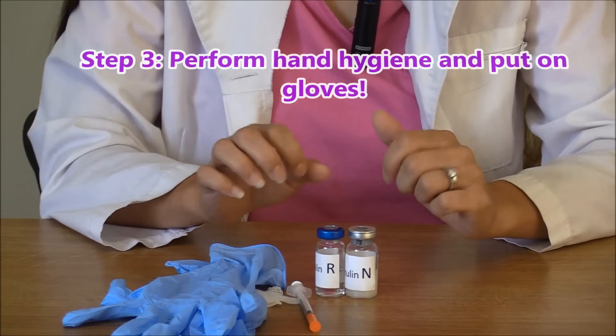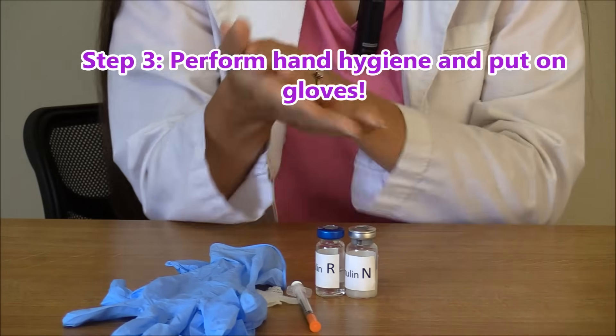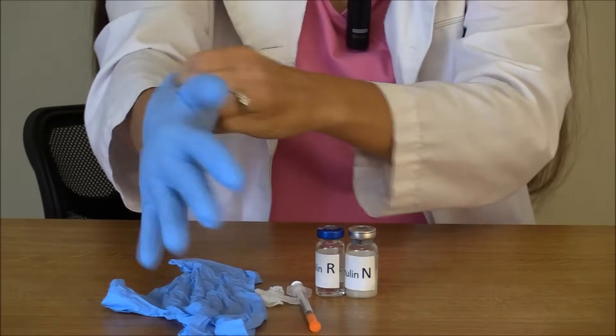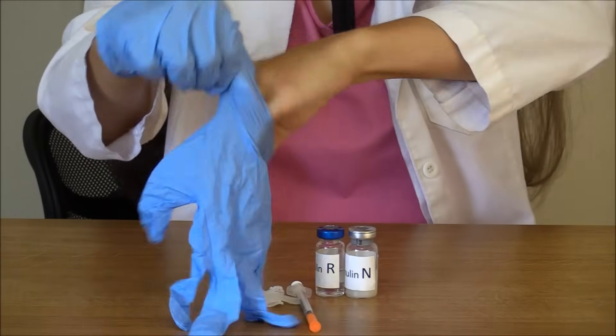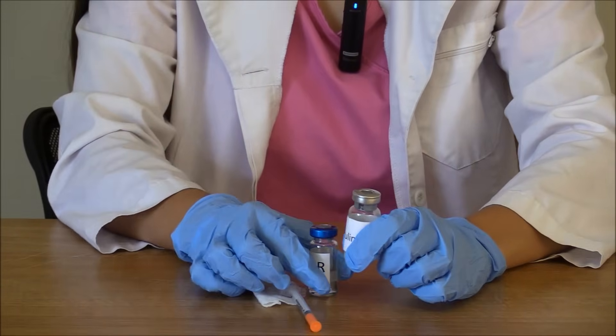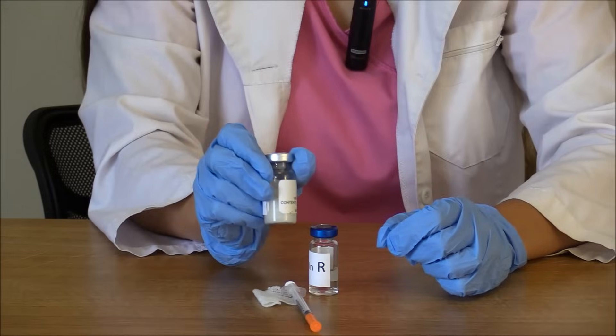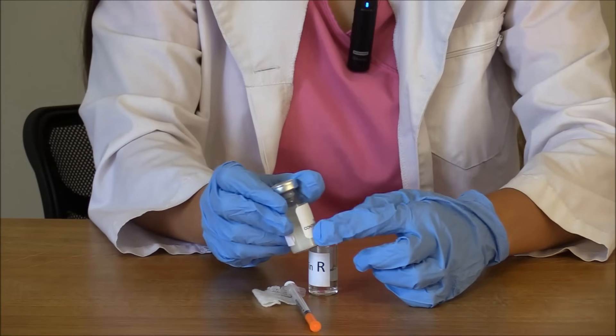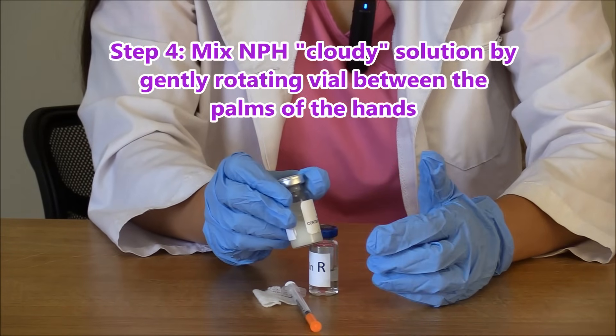Next, we're going to perform hand hygiene, clean our hands, and put on some gloves. After we put on our gloves, we are going to take our cloudy insulin — this is the NPH, the intermediate insulin — and we need to mix these ingredients because they like to settle.